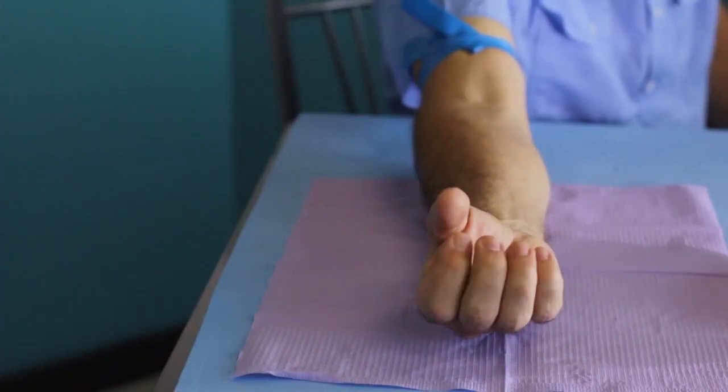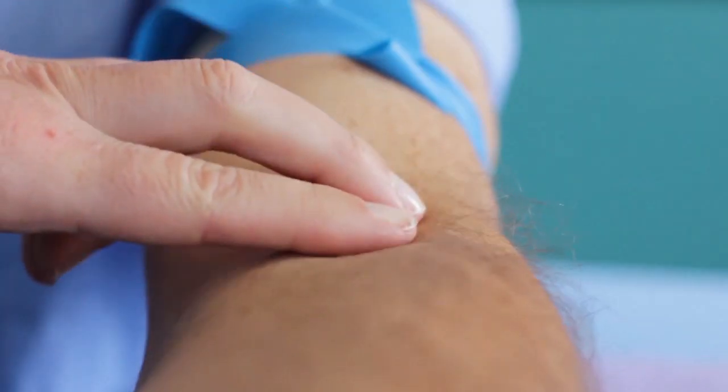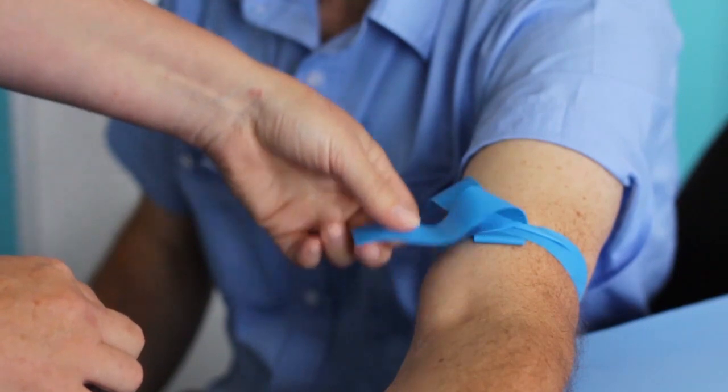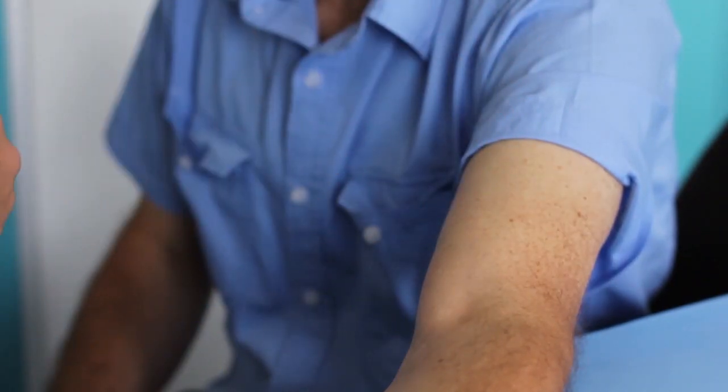Ask your volunteer patient to clench a fist to help distend the veins. Inspect and palpate the veins. When you are finished with the venipuncture procedure, simply pull the free end to release the tourniquet.